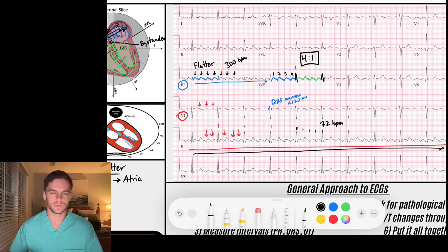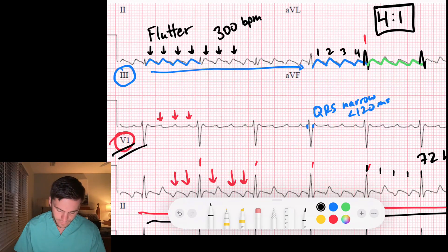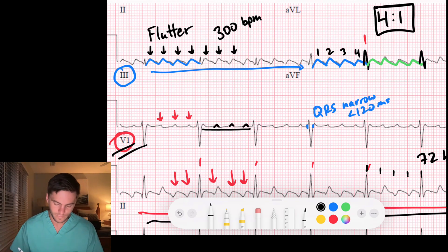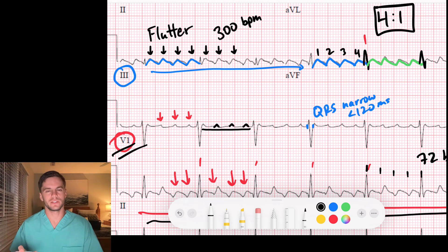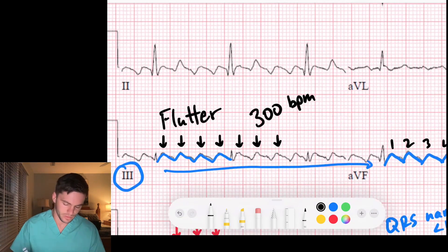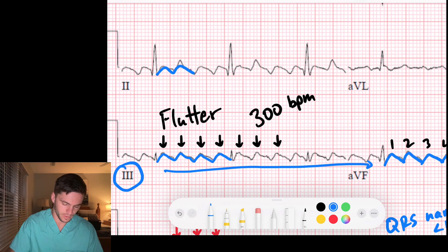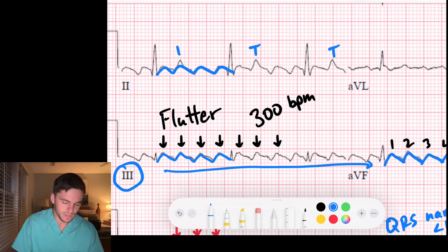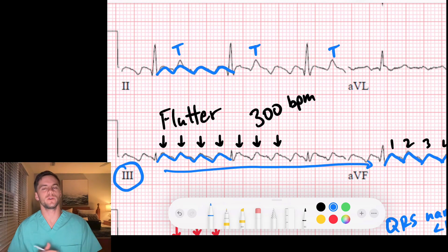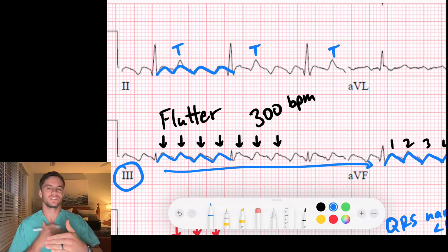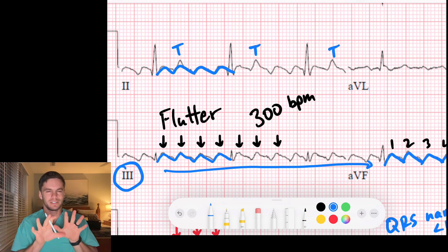A really good lead to use is V1 — it has a nice flat baseline with these sharp, spiky flutter waves. It's important when counting to look for the flutter wave that falls on the T wave. So you see flutter, flutter, flutter, flutter — four to one — but notice these T waves make it a little harder to visualize because a flutter wave occurs simultaneously with the T wave. The flutter is in the atria; the T wave represents ventricular repolarization. You just have to see through it.